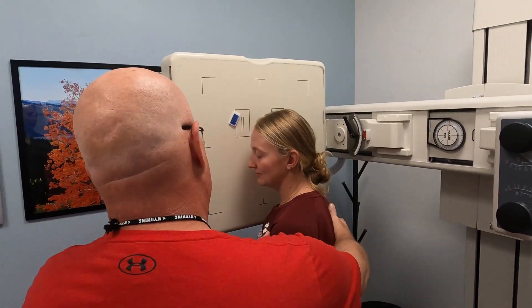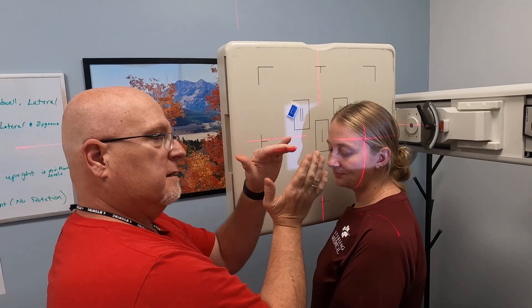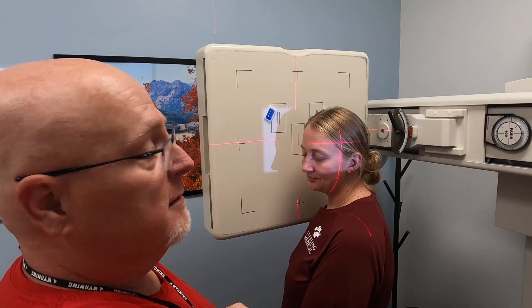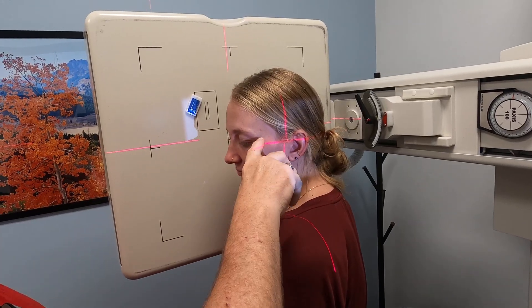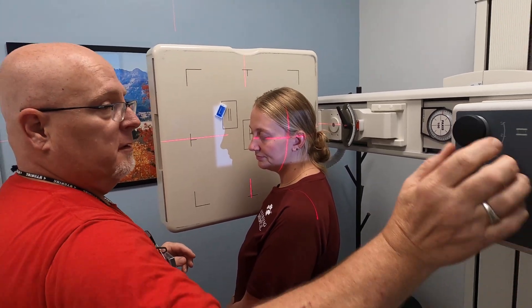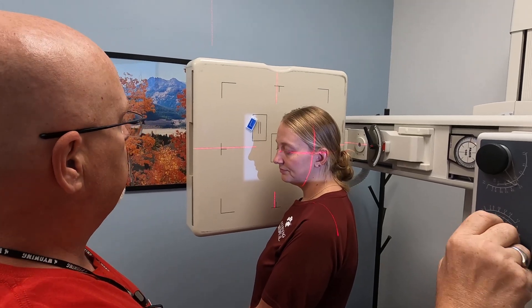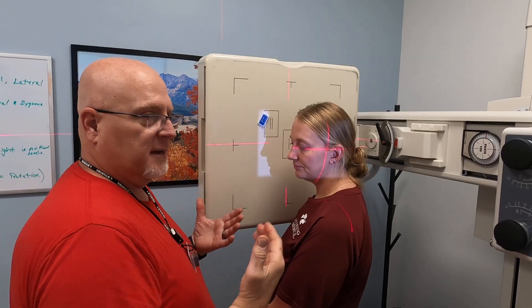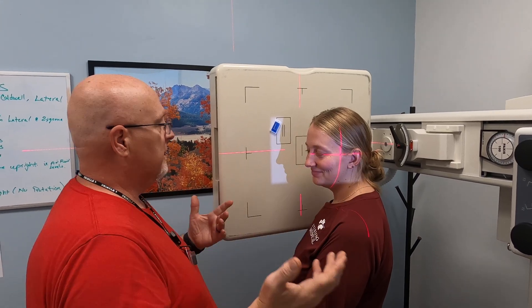Last one — we're going to do a lateral. You can do either right or left lateral, however you're feeling that day. We're going to have Kate quarter into the image receptor and turn her face so it is straight up and down. We don't want it canted either way. Our central ray is going to go right in at the zygoma bone — right in between the outer canthus of the eye and the EAM. That space right in between is where you want your central ray. Collimation wise, we want to make sure we include the frontal sinus and the maxillary sinus, with light on both anterior and posterior sides. We're going to mark this with an L because it is her left lateral.